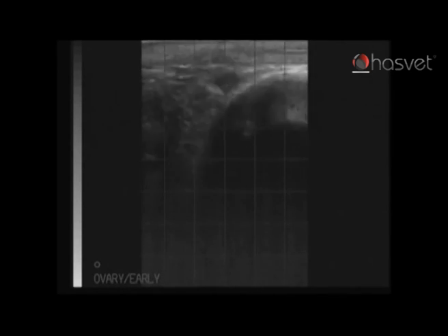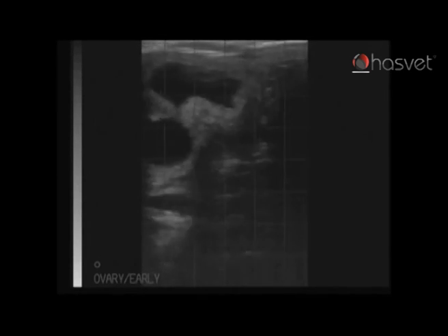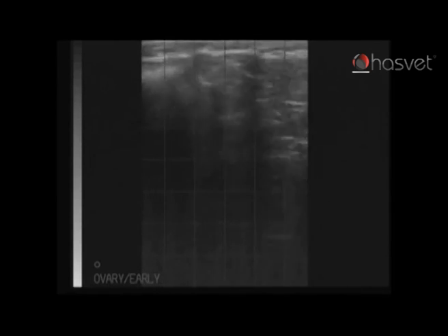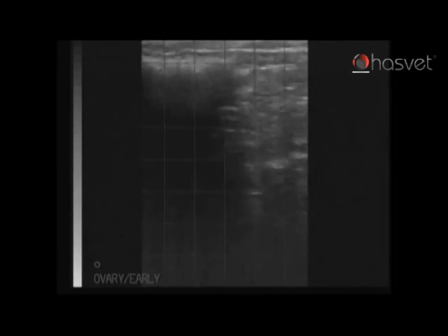The ultrasound probe is now being pushed further cranially, towards the head end of the cow. We are looking to identify the uterus, and in this pregnant cow we can see tubular structures filled with anechoic or black fluid — and there they are. They are quite prominent, giving us a strong indication of pregnancy. This fluid is anechoic — black — with no indication of particulate matter.